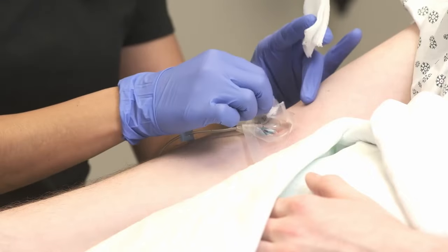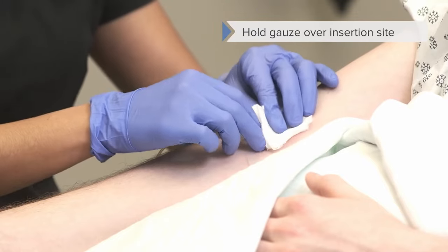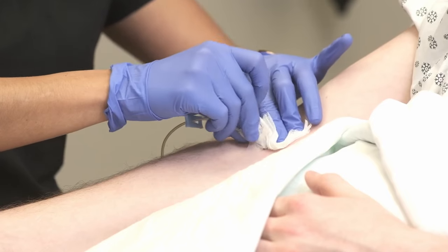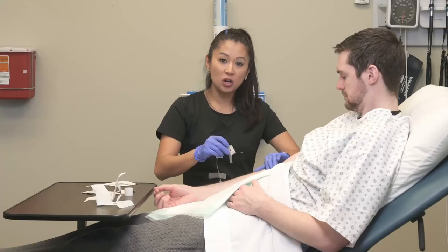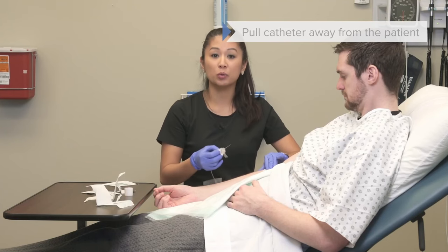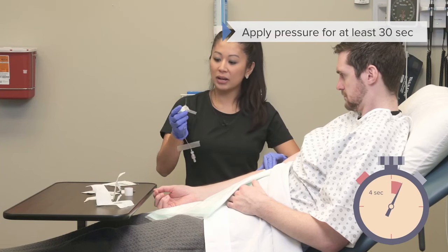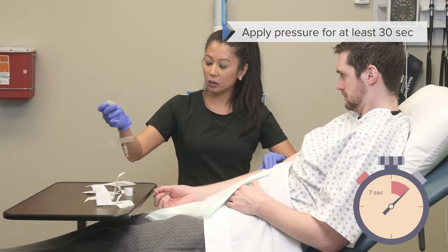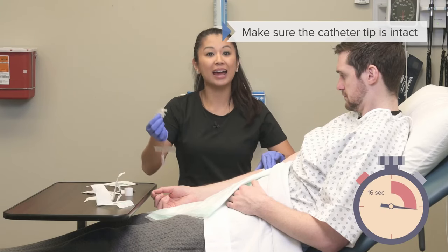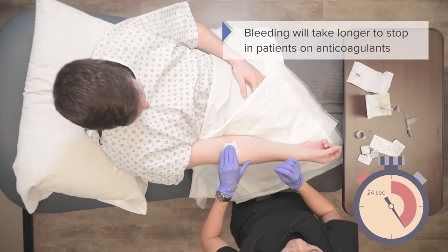Now that we've got all those corners peeled up, I'm going to take my gauze and place it over the insertion site, have everything ready in my other hand, and slowly pull the catheter away. I've kept the insertion site covered and I'm making sure I keep pressure for at least 30 seconds or until the patient stops bleeding. While holding pressure, I can multitask and check that the catheter tip is still intact — which it is. I'll put that to the side and continue holding pressure.